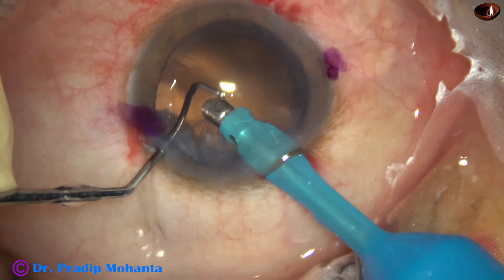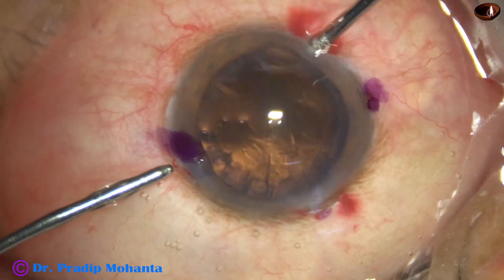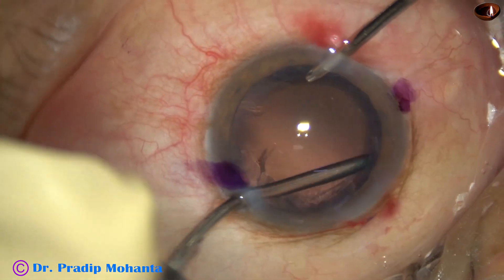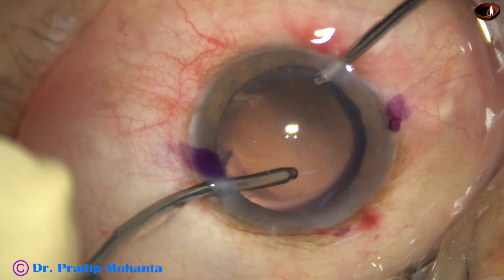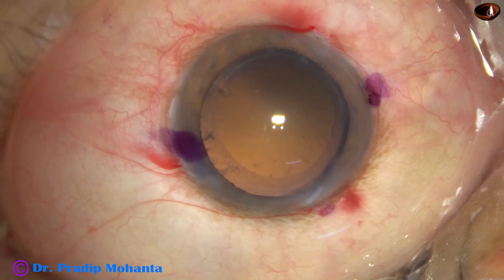I try to remove the cortex using bimanual irrigation aspiration. Still some cortex remains on the left side.